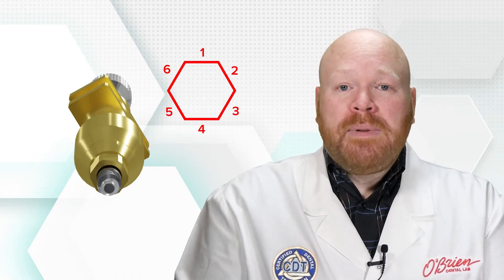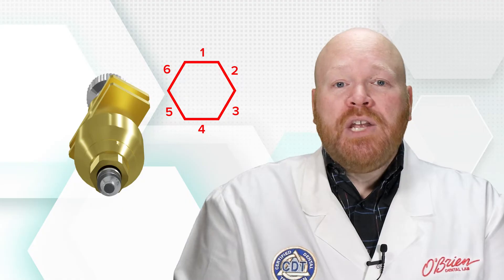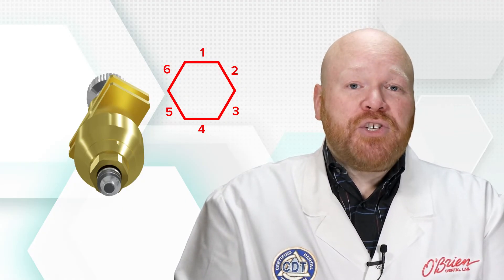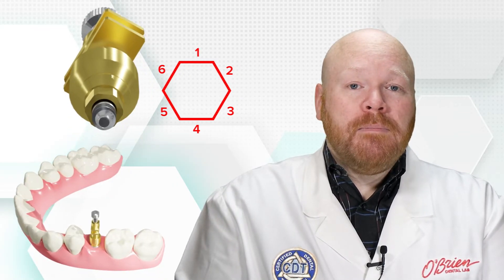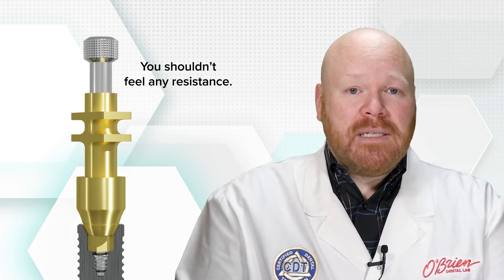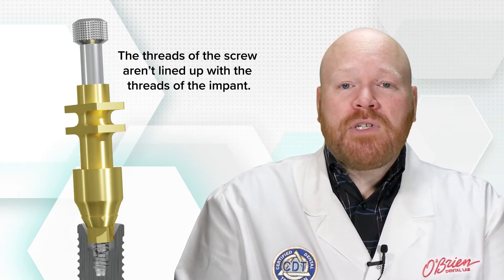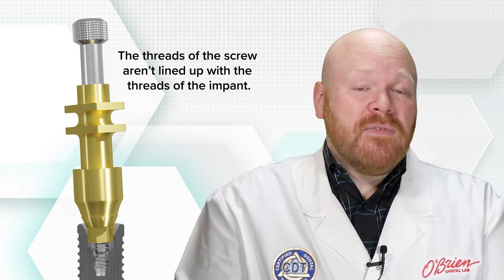There are usually multiple different rotations in which the impression coping can be attached. If the implant has a six-sided internal interface, the impression coping can be placed in one of six different locations. Generally, it doesn't matter which rotation you choose, but sometimes a specific rotation might fit better within the interproximal space. The impression coping screw can be hand torqued, and a torque driver is not necessary. When torquing in the screw, you shouldn't feel any resistance. If you do feel resistance, there's a good chance that the impression coping is not completely seated on one side, and therefore the threads of the screw aren't completely lined up with the internal threads of the implant.